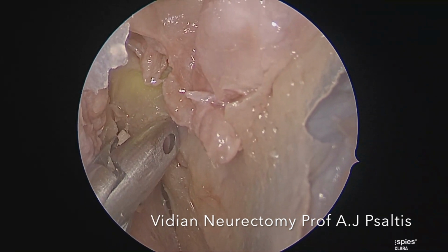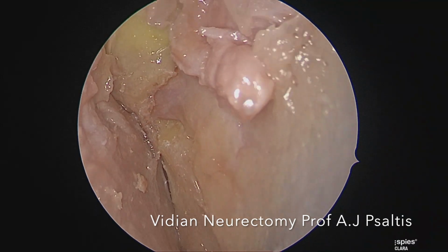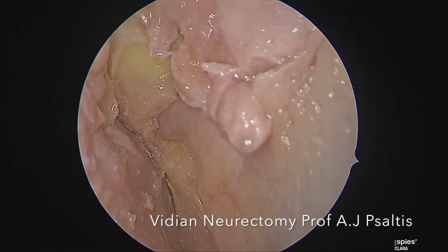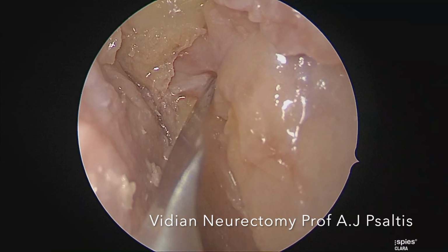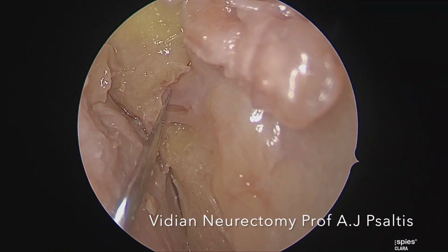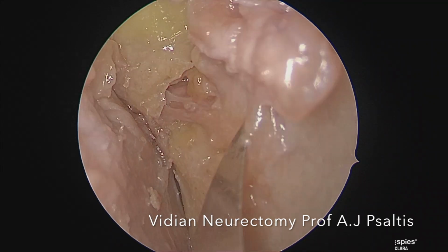The posterior nasal nerve running in the palatovagal canal is often confused with the Vidian nerve and may explain the initial low success rate of this procedure. Using the sharp end of a sickle knife, the periosteum is incised to identify the posterior nasal nerve.